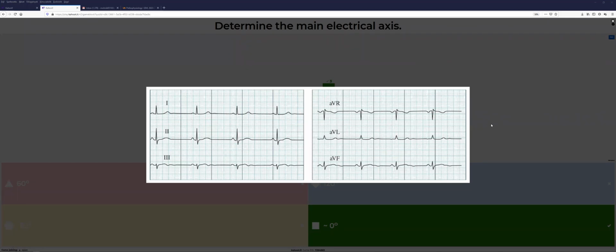So it's a horizontal axis. That's fine. It can be minus 10. Yeah, it's completely normal. However, if you have a young person, usually the axis is close to 90. So it's a skinny one, a tall one, mostly 90. However, if you see a very obese and elderly person and the axis is around 90 or 100, that can be an abnormal sign, and you can say that possibly something else caused it.